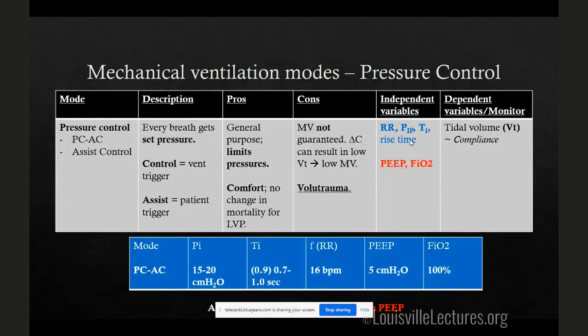Why would I choose this mode? Well, for patients who are awake and who are having difficulty with volume control because of air hunger, I'll choose this one because the patient can dictate the flow rate, and that can alleviate a lot of need for sedation.